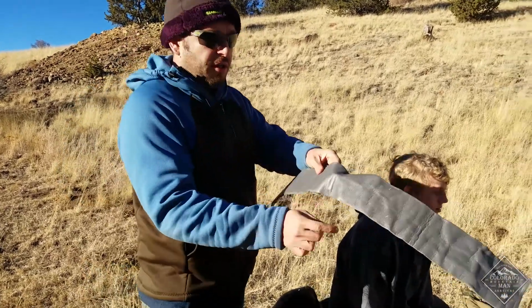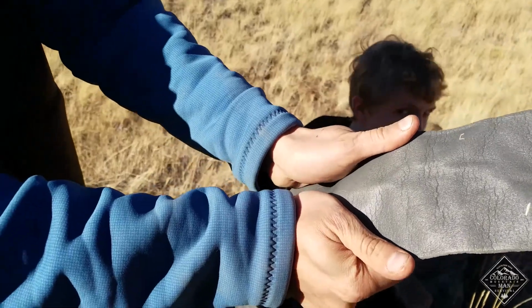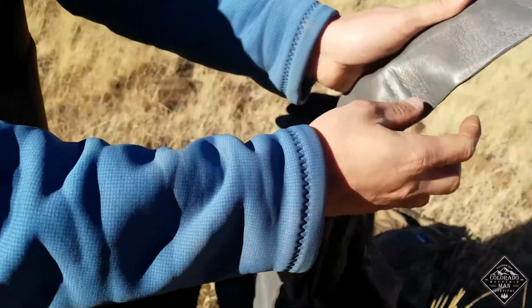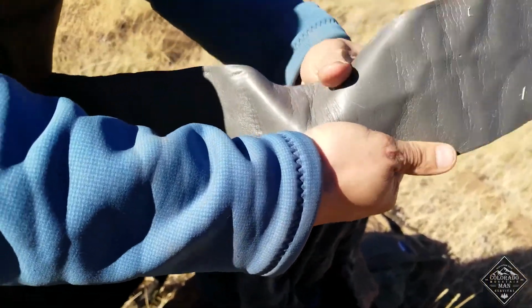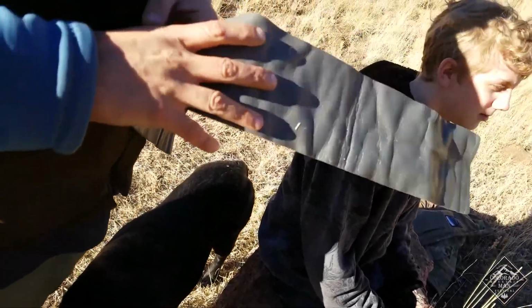In the middle, about two-thirds of the way up, we're going to fold it in. I'm using more pressure with my left hand than my right. So I want just a little indentation, and I want that to be damn near flat. That's where the chin's going to go, right? So you want to be able to come in there and do the Darth Vader choke.